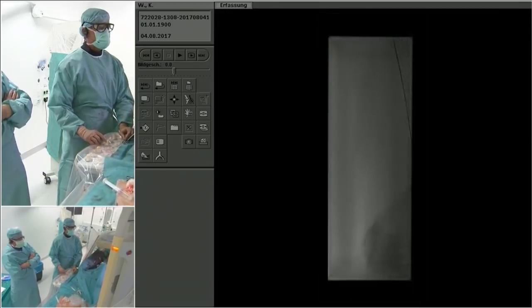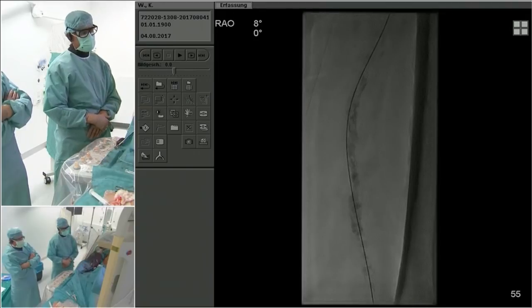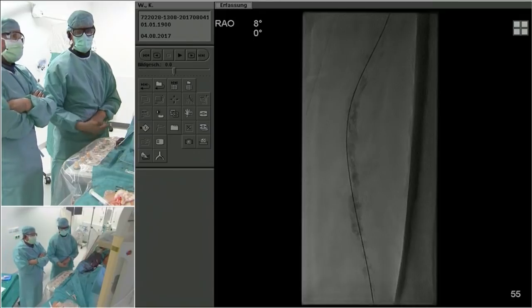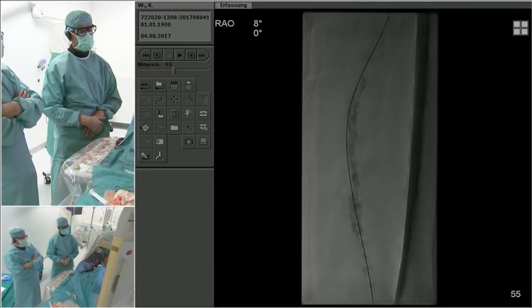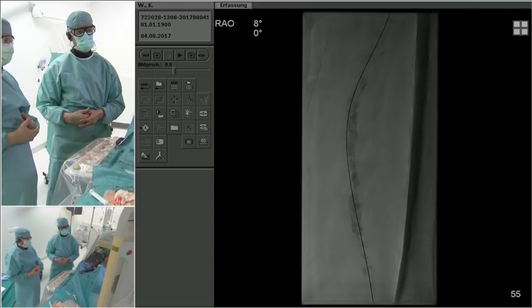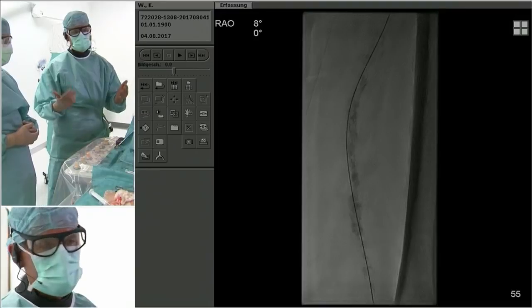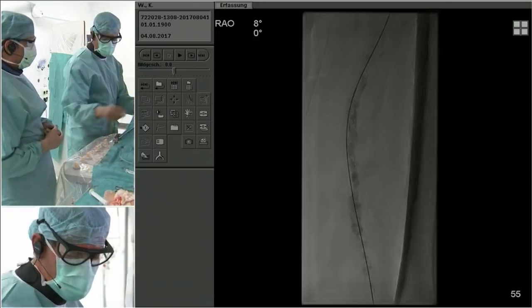Would you consider atherectomy devices in this severe calcium? Well, it could help to open the balloon, but it will be so cumbersome to use, and I think the risk of embolizing here is so extremely high. Taking a Viabahn in first sometimes gives you just a very much safer feeling of preventing embolization. For example, in CLI patients, if the Viabahn is in, you can do whatever you want, no risk of embolizing. So I think that's a great question for the audience and for the panel.